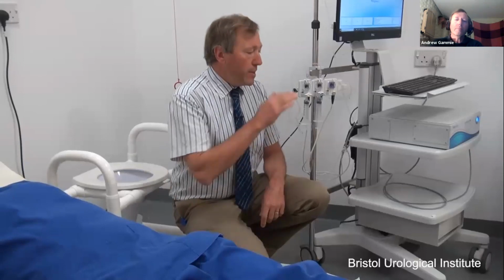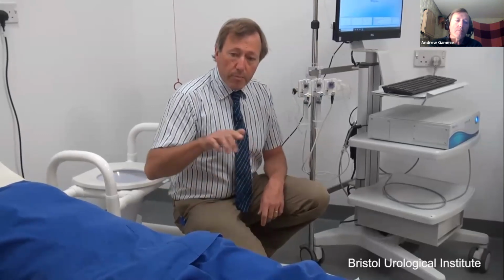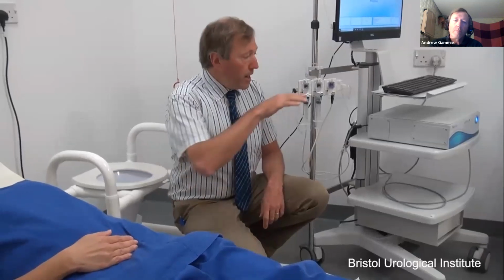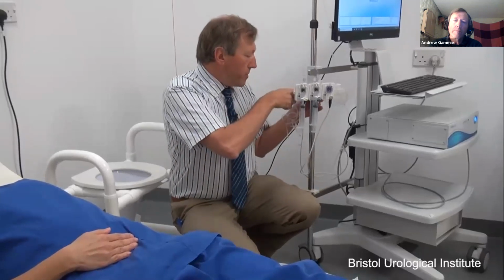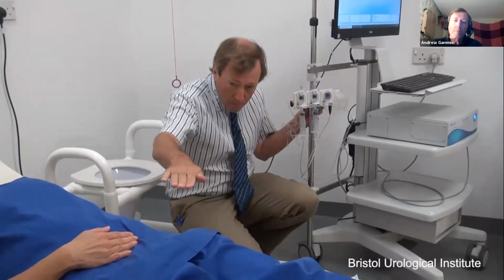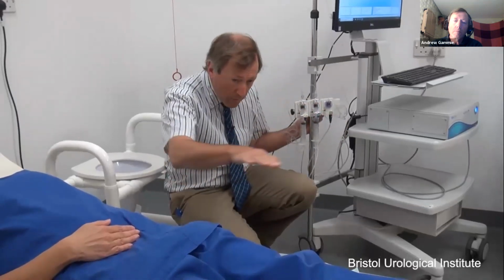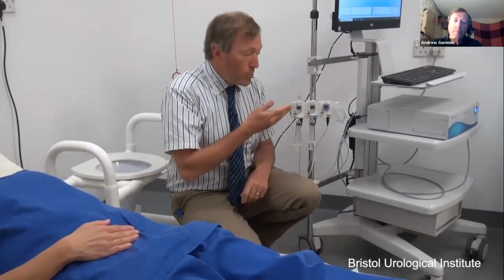When we're measuring with water-filled systems, it's important that we get the level of the transducers right for the position of the patient. And the reference point that we use is the pubic symphysis bone. So when the patient is lying down, as here, I need to move these domes down to be at that vertical level. So I look at it just by eye, and I get the opening hole of the dome level with the symphysis pubis and tighten it up. And now I'm at the right level for measuring patient pressure.